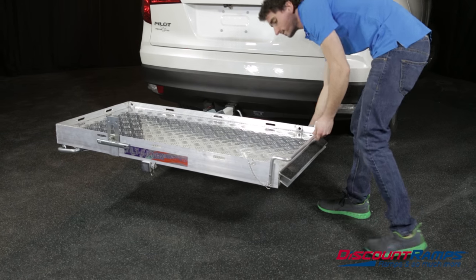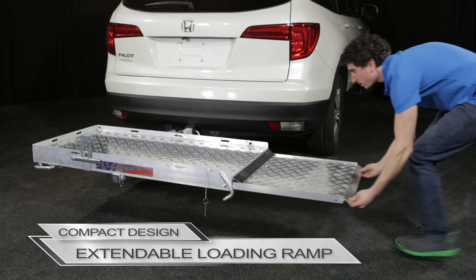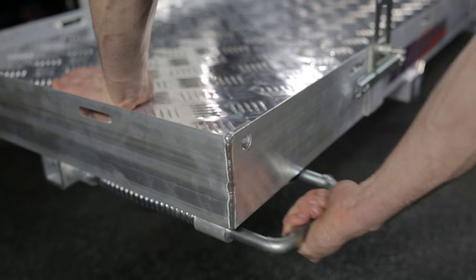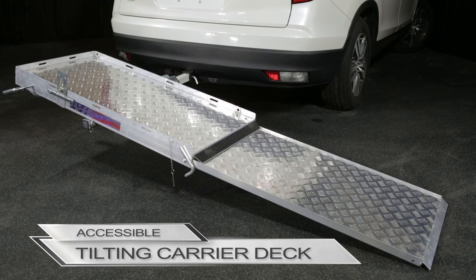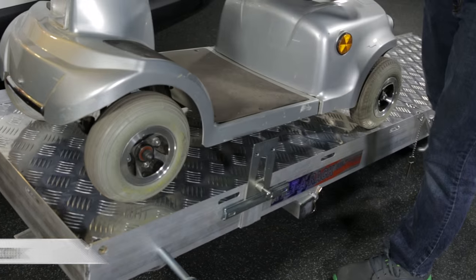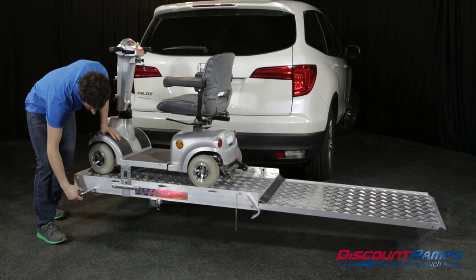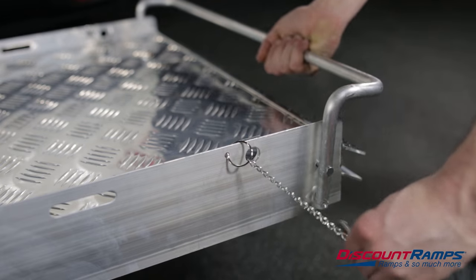To use this carrier, simply pull out the safety pin, extend the built-in ramp and pull the tilt handle. Then, utilizing the natural effect of gravity, the tilting carrier deck folds down into an accessible gentle sloping ramp. Once your scooter is loaded, simply replace the handle, load up the ramp and secure the pin.